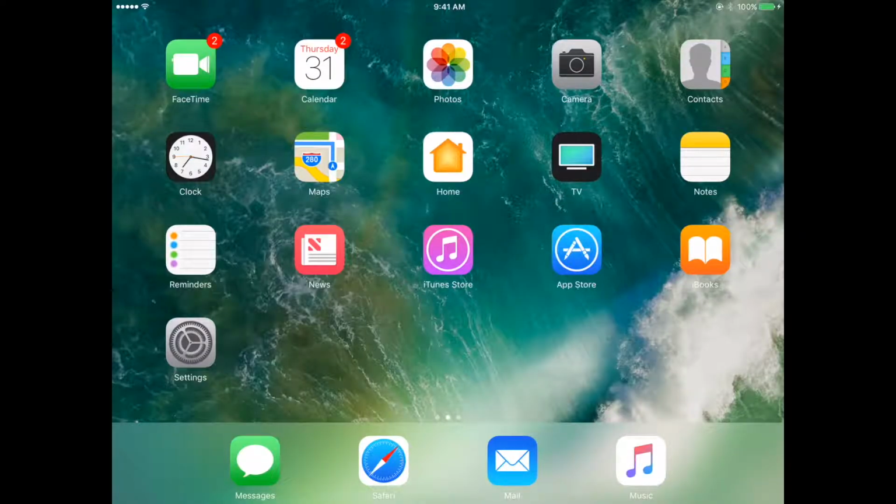Before we get into the specifics of Dan's speech app, we're going to review some general iPad settings and areas of troubleshooting. These include guided access, how to enable and disable it, what to do when the iPad freezes, and how to force quit the Lamp app, and how to manually update the iPad iOS software and the Lamp app.